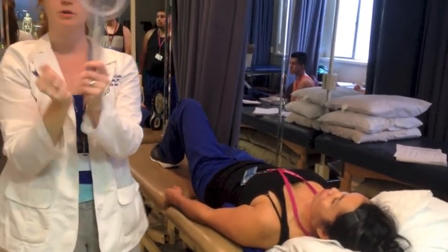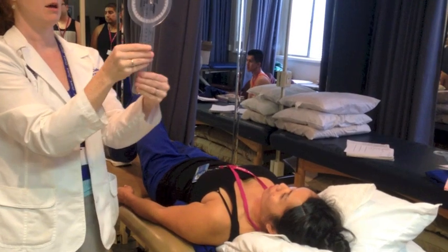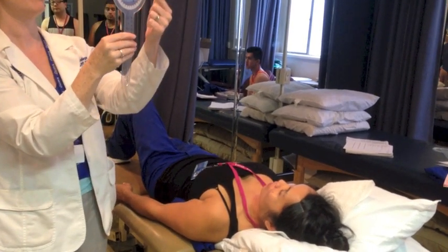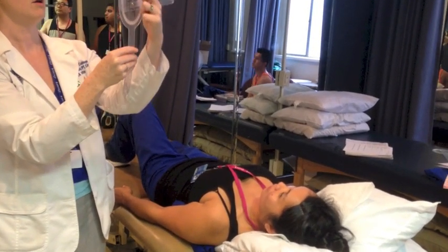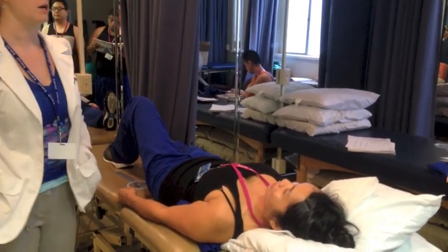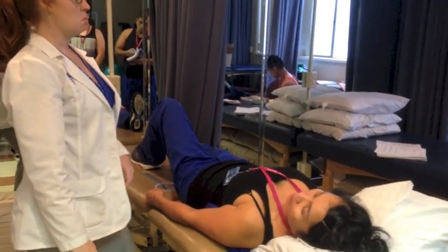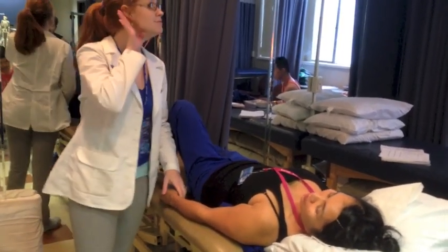What numbers are we looking at right here? And then as they abduct overhead, we're going to follow these numbers up. What is normal? Same as flexion — 180 degrees.